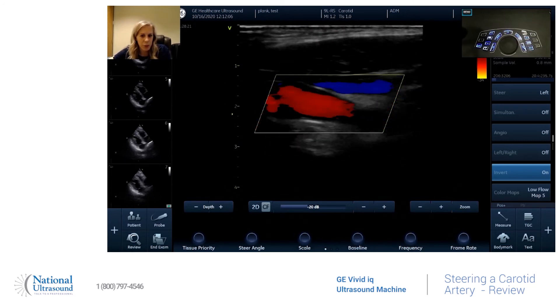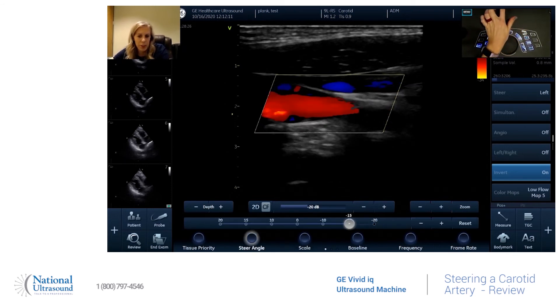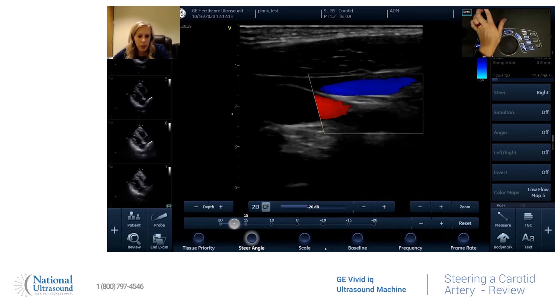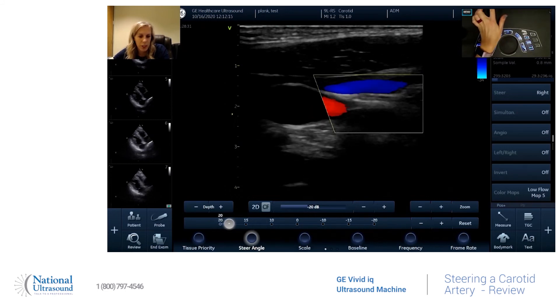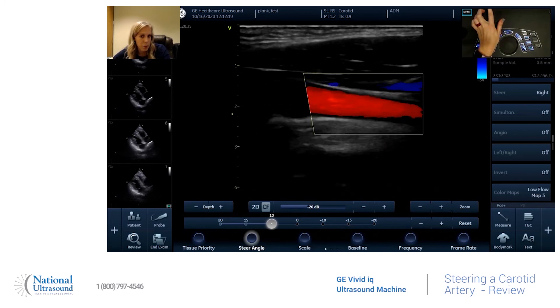If you have it the other way and you want a different view, you hit steer angle again and then just move it back to where it was before. You can adjust the angle to however you need it — whether that's 15 or 10, whatever will get you the best image for the color.